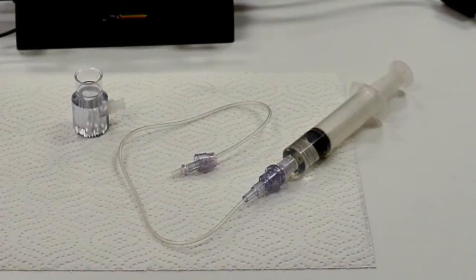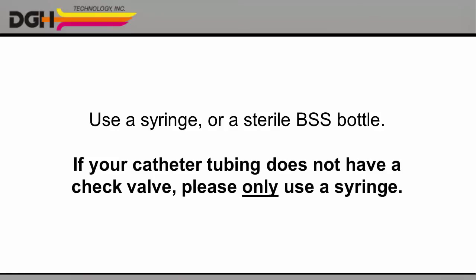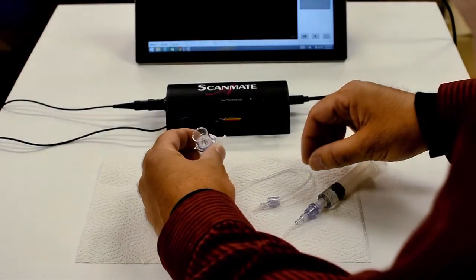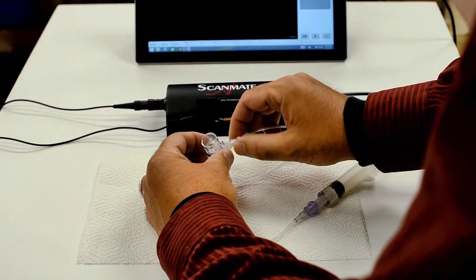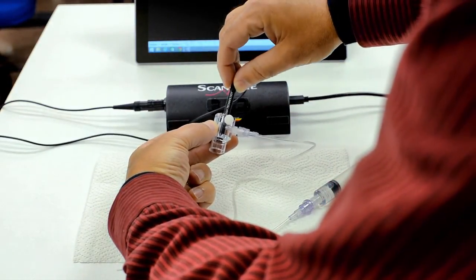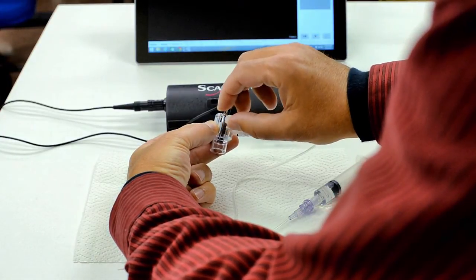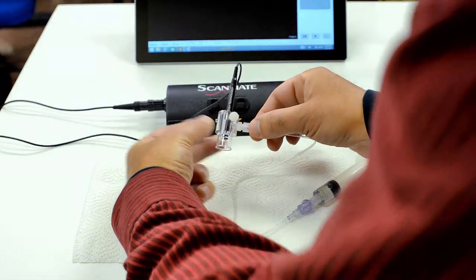Please note, the catheter tubing provided with the Prager shell includes a backflow check valve, so you can use a syringe or a sterile BSS squeeze bottle as your reservoir. If you're using your own catheter tubing without a check valve, please only use a syringe. Now connect the catheter tubing to the Prager shell. For help, please refer to the instruction sheet included with the Prager shell. Next, gently insert the ultrasonic probe into the shell until it stops and secure it with the set screw. Make sure the probe is secure and tighten the screw as needed.